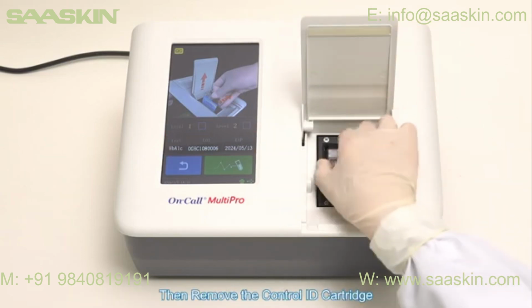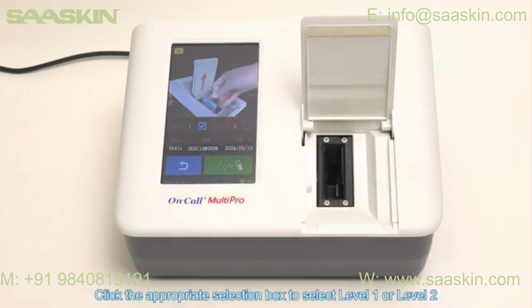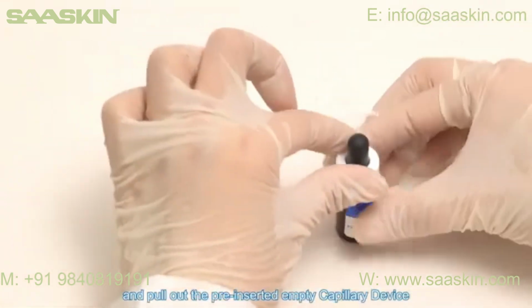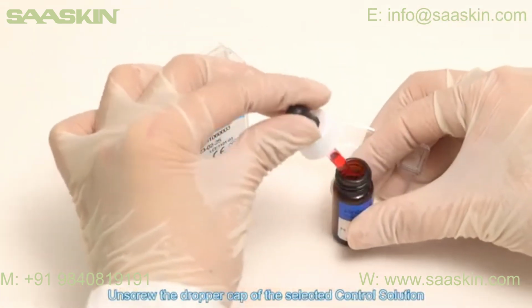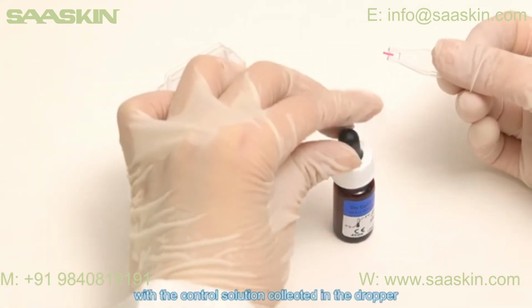Open the cover, then remove the Control ID cartridge. Click the appropriate selection box to select Level 1 or Level 2. Take out a new HbA1c test cartridge and pull out the pre-inserted empty capillary device. Unscrew the dropper cap of the selected control solution and fill the capillary in capillary device with the control solution collected in the dropper.